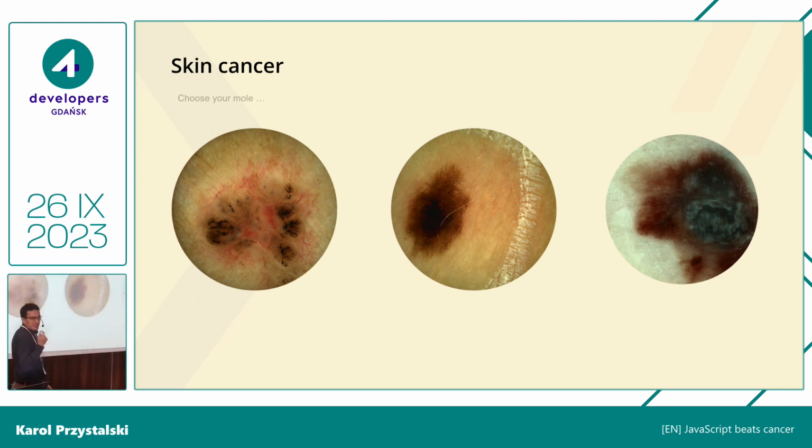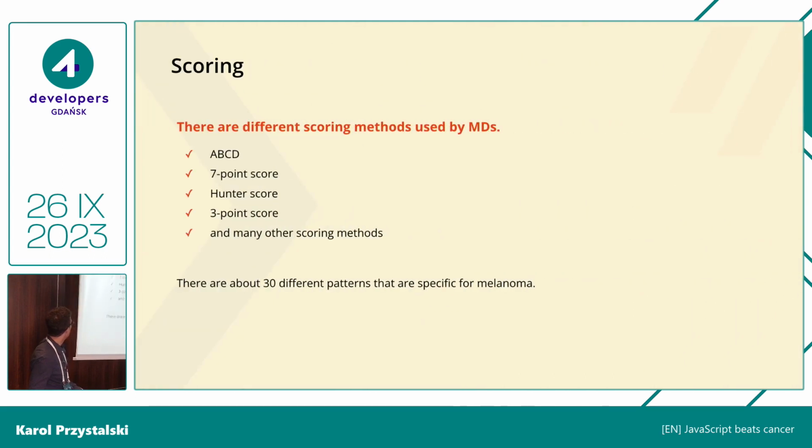It's weird because it's blue, kind of blue-gray, right? Why blue-gray? This one is suspicious, but that's not a cancer. It's suspicious because of some patterns, like the stripes here. Here it's not regular, right? Also, it might be a cancer, but that's only suspicious. And this one is just a normal mole, no cancer here. So this is how it looks.